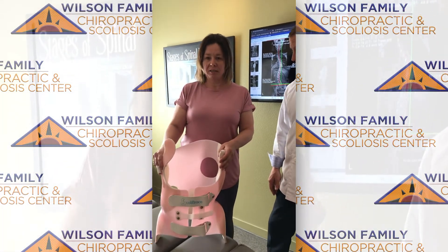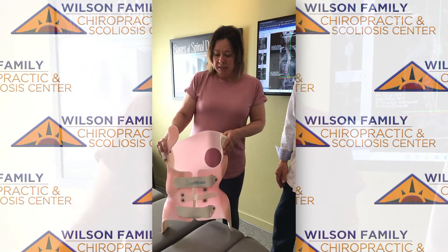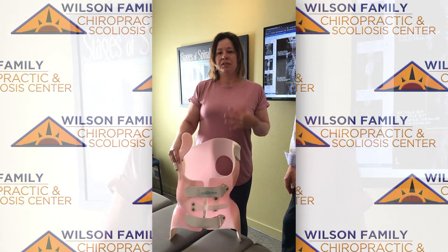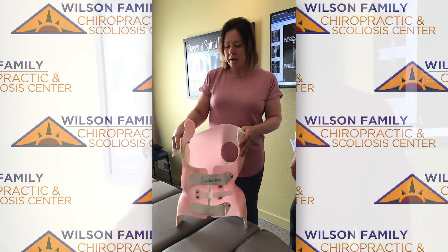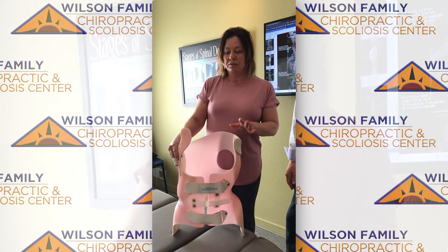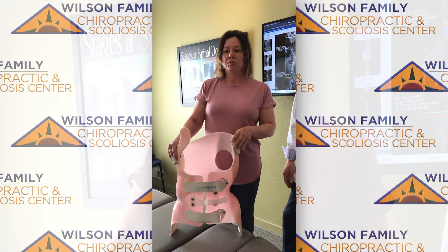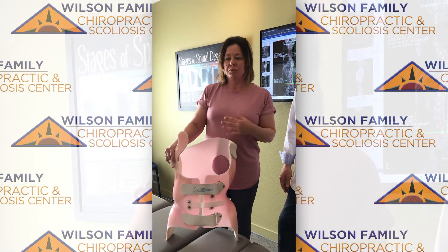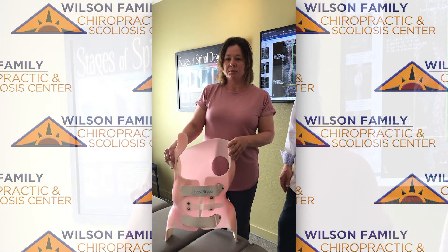Just to let you guys know what to expect when you do get your Scoli brace. It is a little scary at first because it's hard and it doesn't fit your body as well as it will in time, but it does form to your body and it gets so much easier. I wore it for the first two weeks, trying to wear it a couple hours a day, and then the doctor informed me just to push through the pain because you will have some discomfort wearing your brace, but that means it's working.